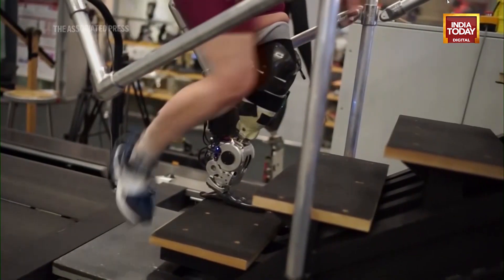Those data are then decoded by small computers on the robot that tell the machine how to move — what forces or torques to apply to enable natural movement by the person with amputation.